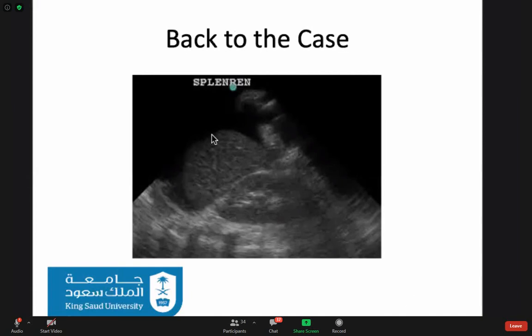So you can see that the patient has free fluid. So this is the interface. The interface is what's between the spleen and the kidney. This is the diaphragm. This is fluid just around the spleen now. So you have left upper quadrant fluid present. So this tells you that the patient has, like you suspected early on, an abdominal injury with free fluid in the abdomen and tachycardia. You've started fluids, but she has a positive FAST now.